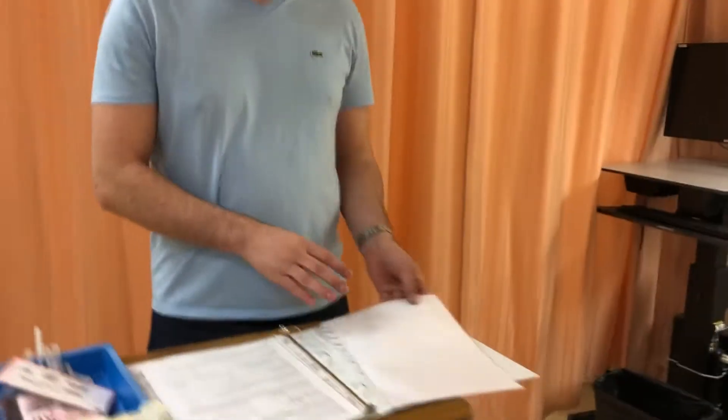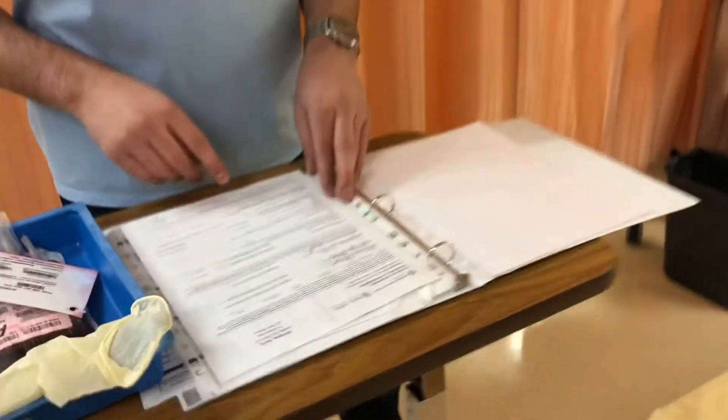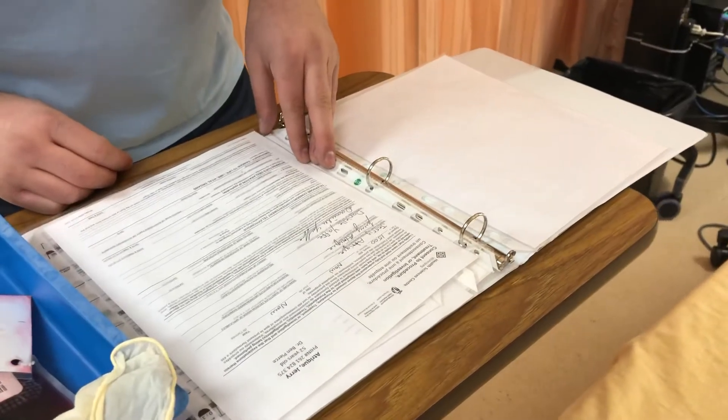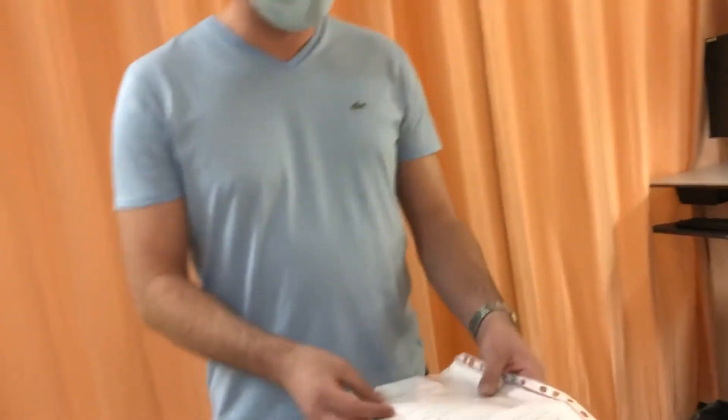Now that I've reviewed the physician's order, I'll make sure the consent form is signed. It's been signed by the patient as well as the witness, so I'm done with that.